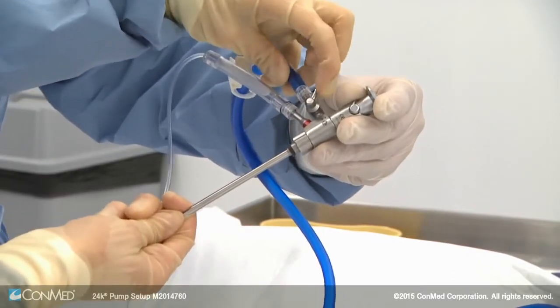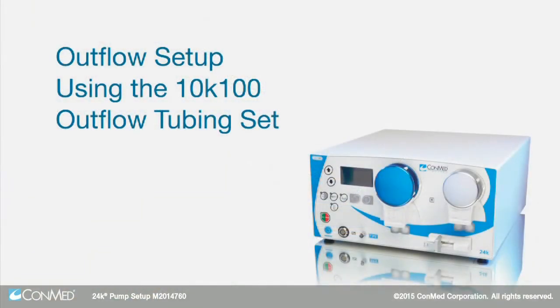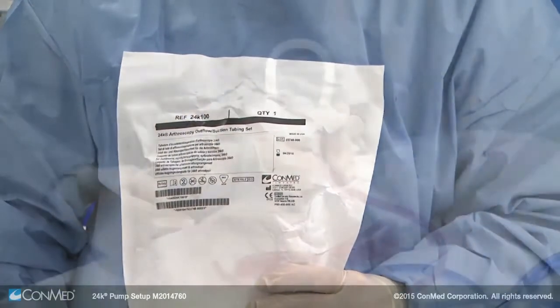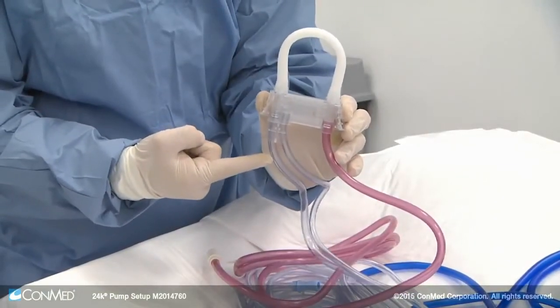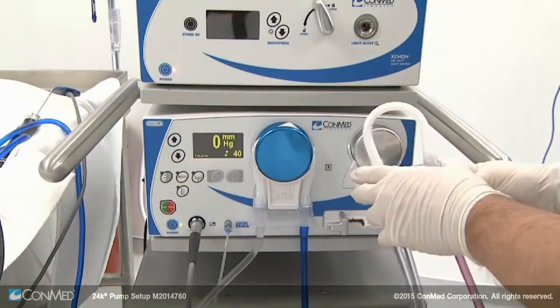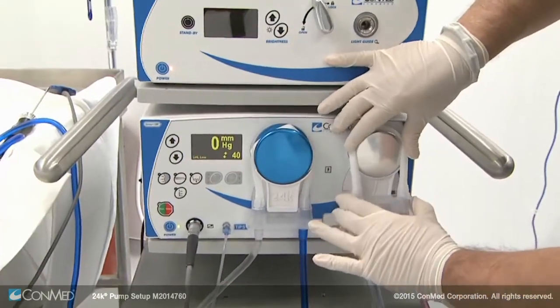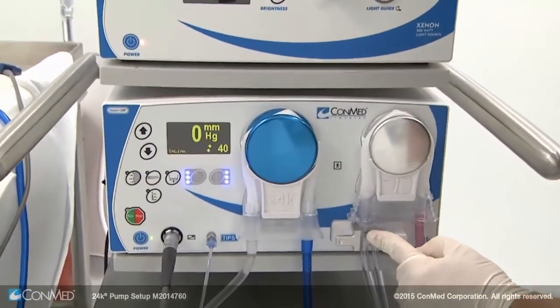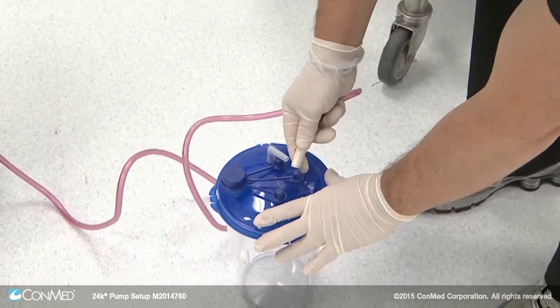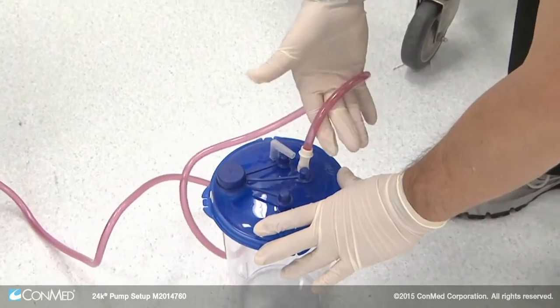To add outflow to your procedure, open the 24K 100 outflow tubing set. This cassette features three tube lines: shaver suction, outflow, and waste. Install the cassette over the silver outflow rotor of the pump and press the cassette button in to ensure proper installation. The pink waste line can connect to any waste collection equipment.